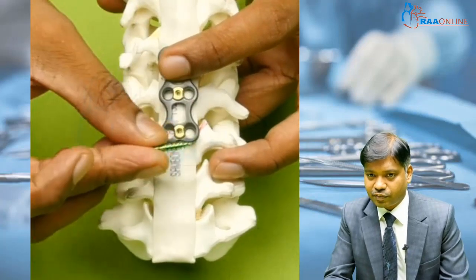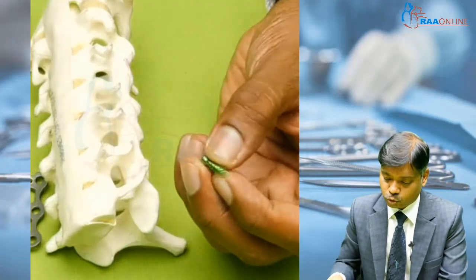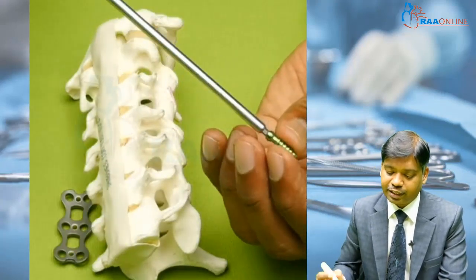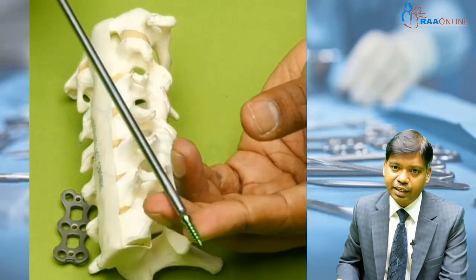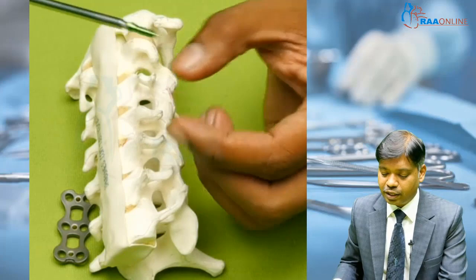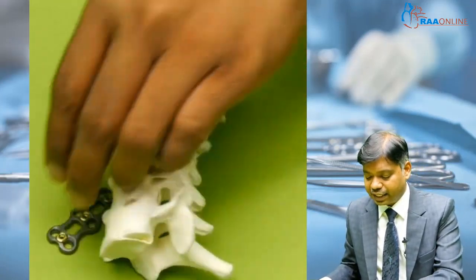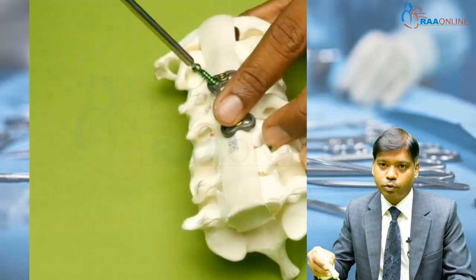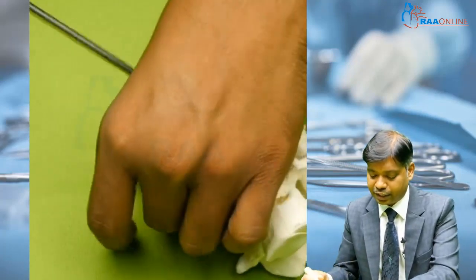These screws in the cervical spine are self-drilling and self-tapping screws. So I personally usually do not use an awl or probe for anterior cervical spine. You use a screwdriver, and this is a self-drilling, self-tapping screw. So you will be able to insert the screw through the plate into the bone directly with ease without any problem.